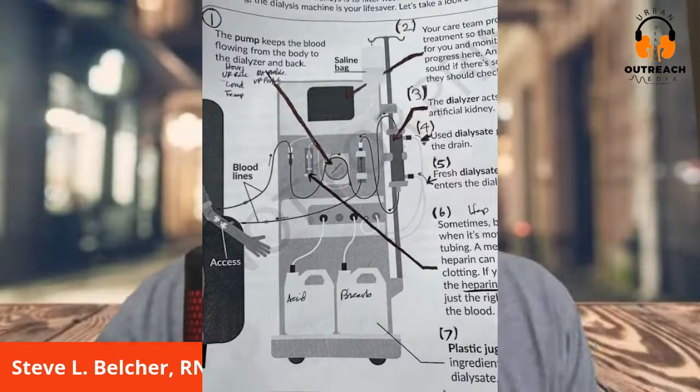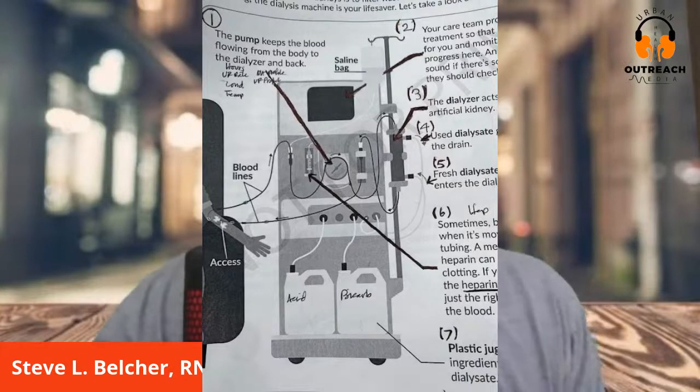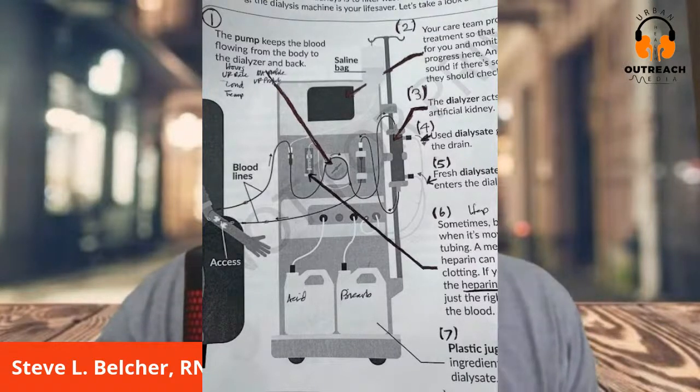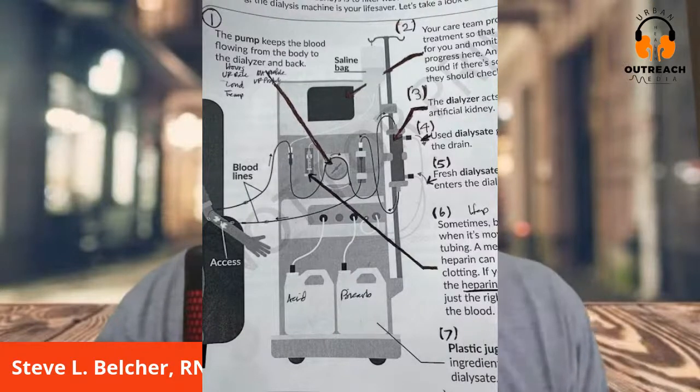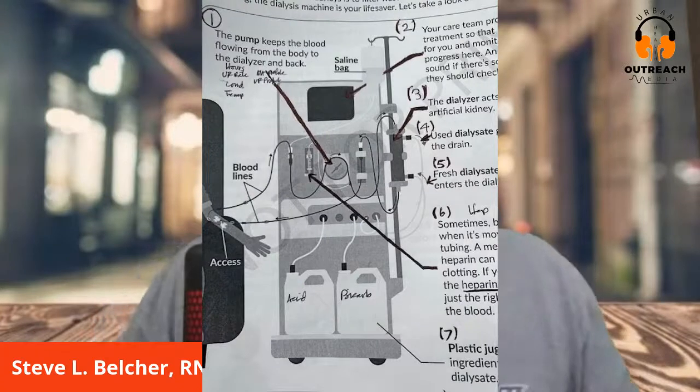And then number seven is the plastic jugs. On some machines, when you have this, it is called single station. Where you get units, they got what's called a central delivery system, where they make this solution somewhere else, and it comes up through hoses and through the back of the machine. They take these same lines that's going in the acid in the bottle to the wall stations.